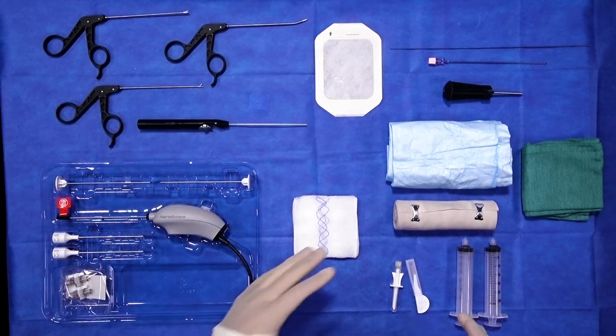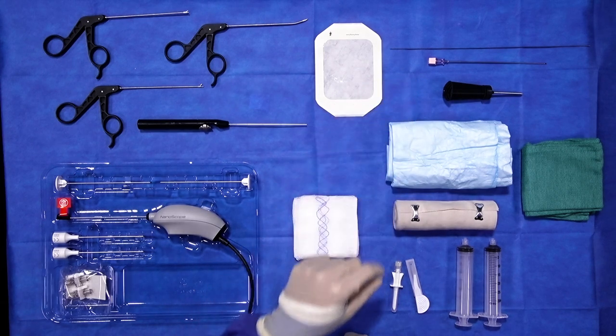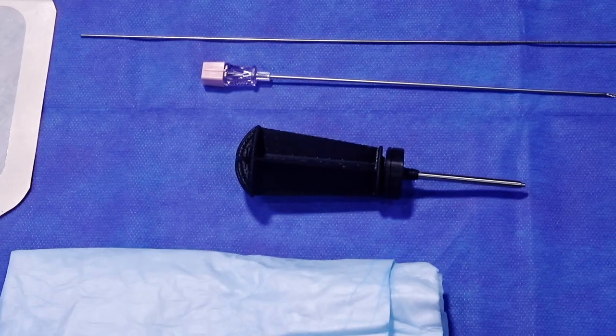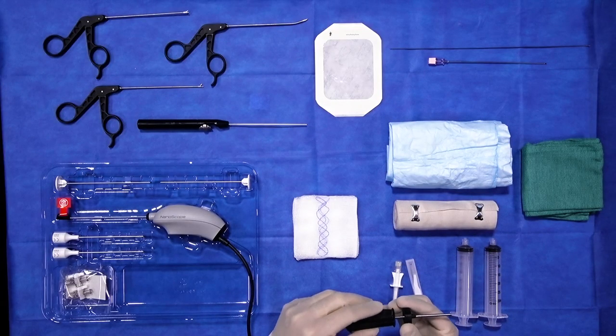I do want to talk a little bit about the instrumentation to access the joint. You can see on the top right side of the table are the tools that we use to place the nanoscope. Everything can be done through placement with a spinal needle and a guide wire, and then what's placed over the top is this disposable obturator and cannula system.